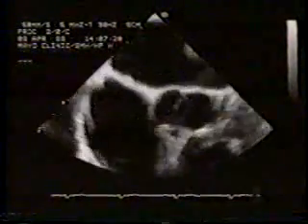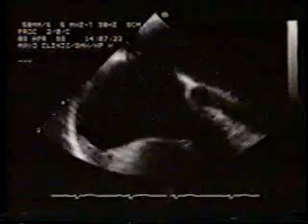The defect in the mid portion of the atrial septum can be clearly visualized. Note that the lower portion of the atrial septum as well as the uppermost portion of the atrial septum is intact. In real time, you can see the defect clearly as well as the margins of the fossa ovalis membrane.